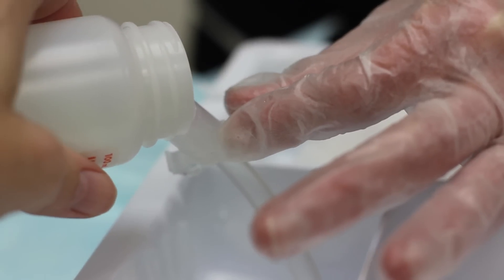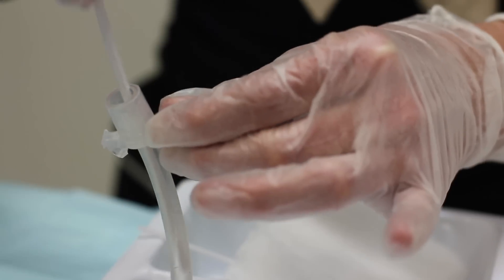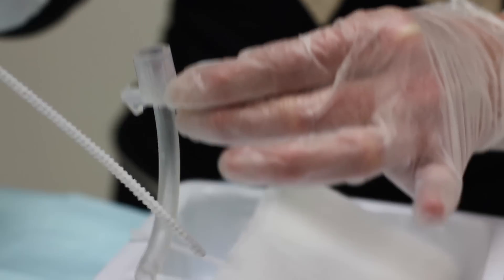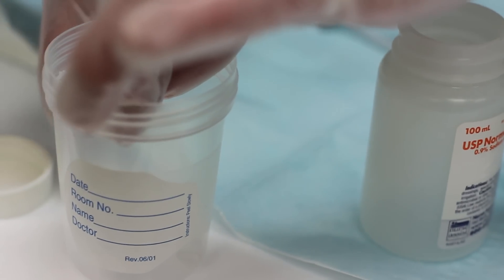Since hydrogen peroxide is used, rinse the cannula well with saline after washing it, dry it with pipe cleaners, and place the cleaned cannula in a clean sterile container labeled with date and time, to be placed at the bedside. If the patient has a long-term trach tube, there may be only one inner cannula, and you'll follow the procedure to clean and replace the cannula itself.